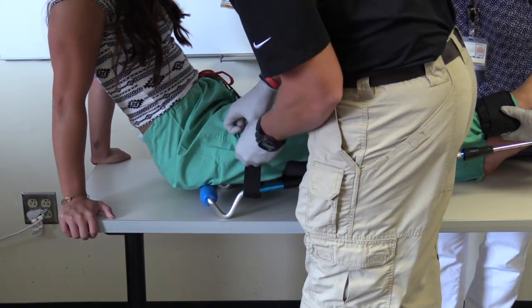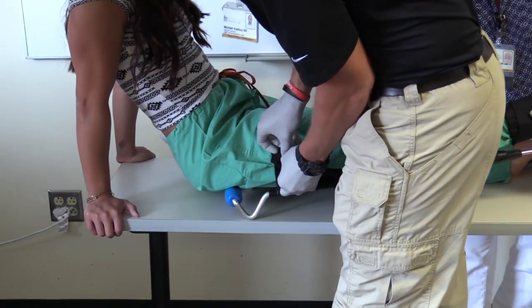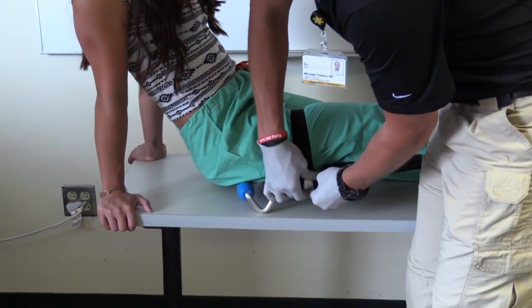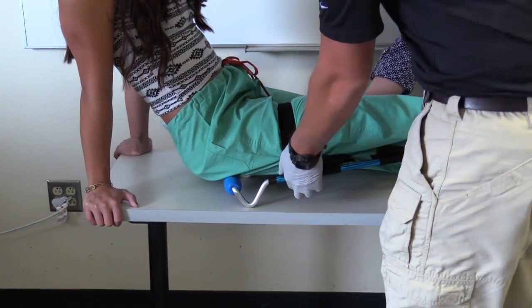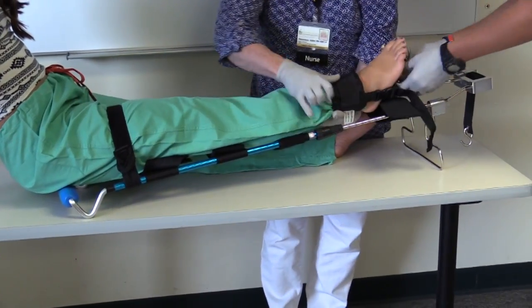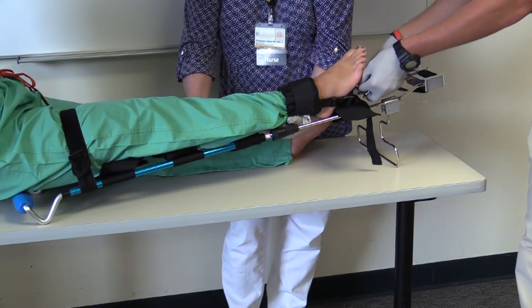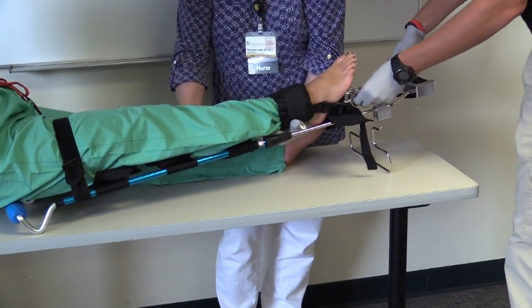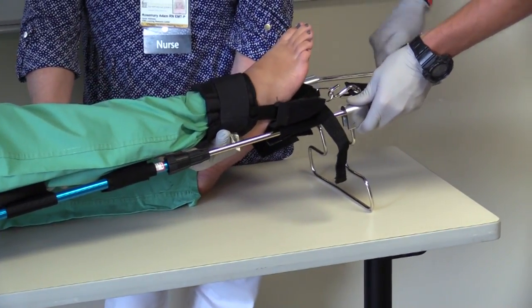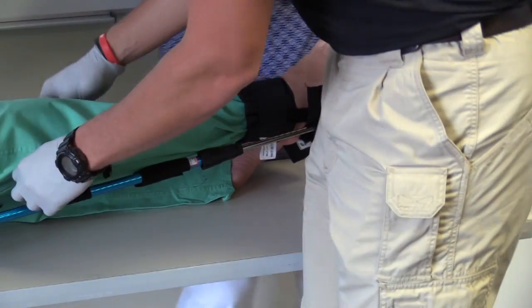I will then attach the ankle hitch to the device and apply traction to the extremity by tightening the strap. Using the traction splint, I will pull traction until the patient reports feeling relief. I will then secure the limb to the device using the support straps, while making sure I do not secure the strap over the injury site or the knee.